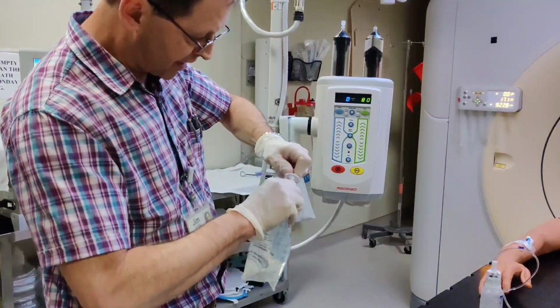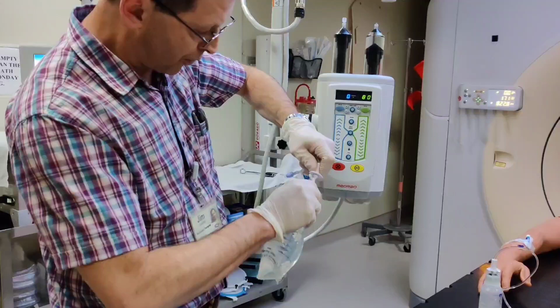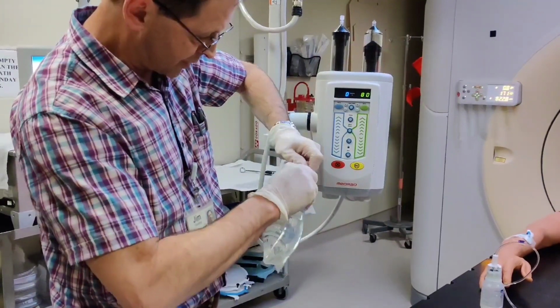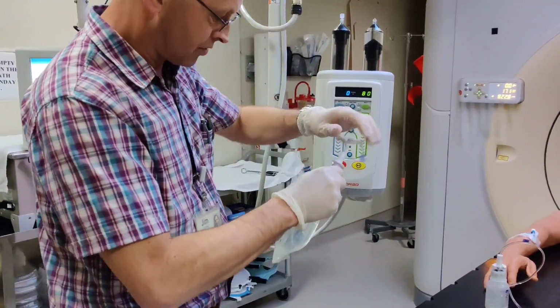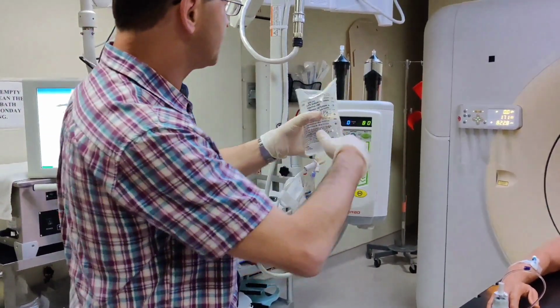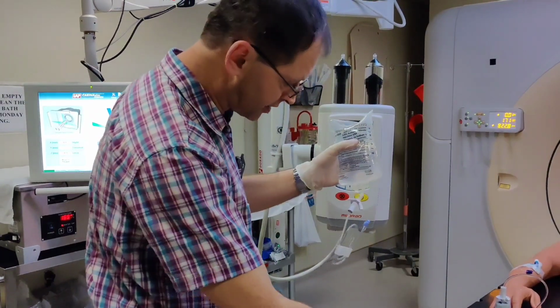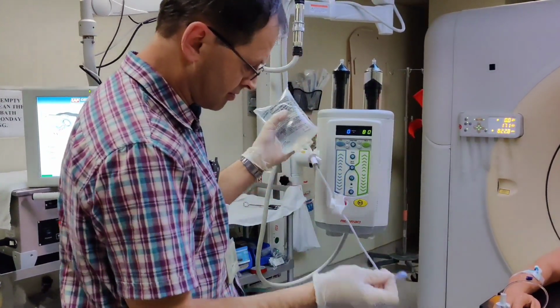And be careful here, you can actually impale yourself. I want that to go in all the way, right as far as it'll go. So I'm now good to go at that end. So like with the contrast, I'll take that off again, being careful not to contaminate anything.